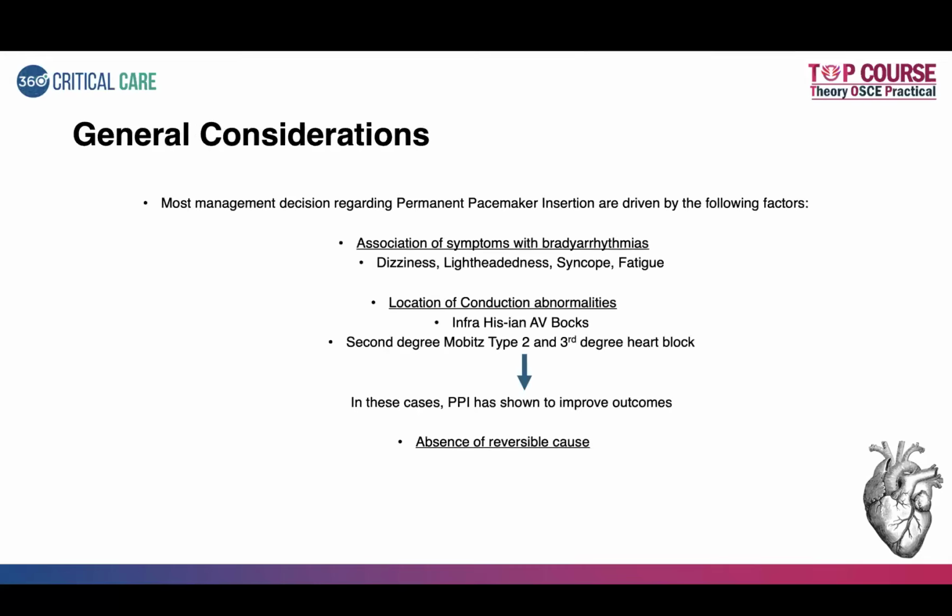So the general consideration is most management decisions regarding permanent pacemaker insertion are driven by the following factors. One is the association of symptoms with bradyarrhythmias: dizziness, lightheadedness, syncope, fatigue. Like in your AHA algorithms, you have this CHAPS, that is chest pain, heart failure features, altered mentation, poor peripheral perfusion, low BP. All these features also can be looked into.